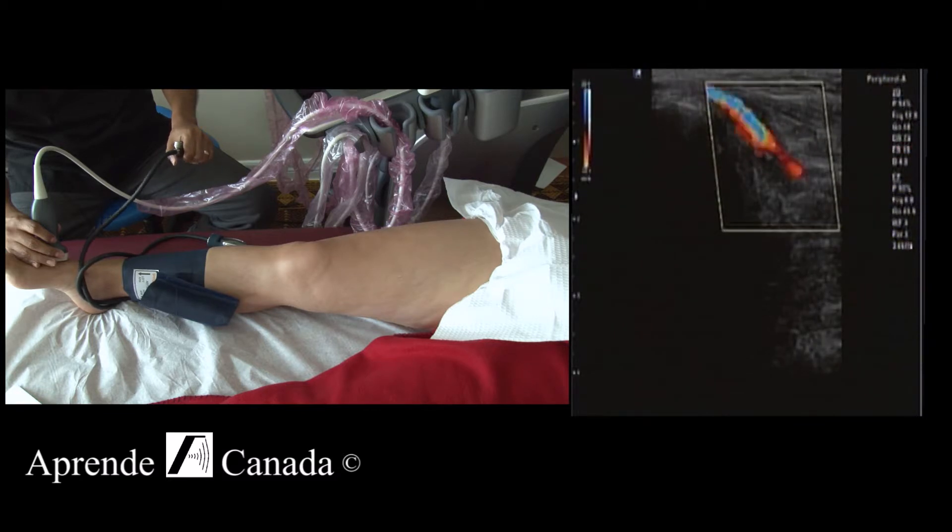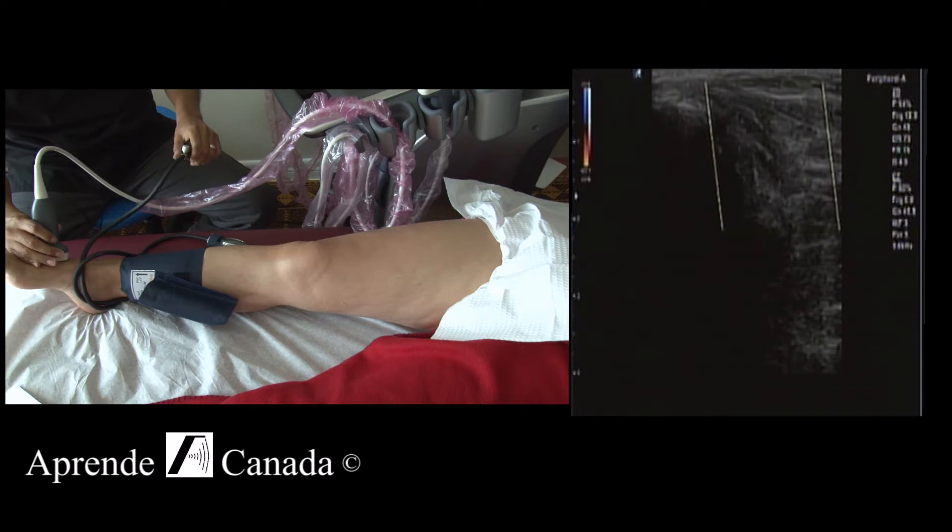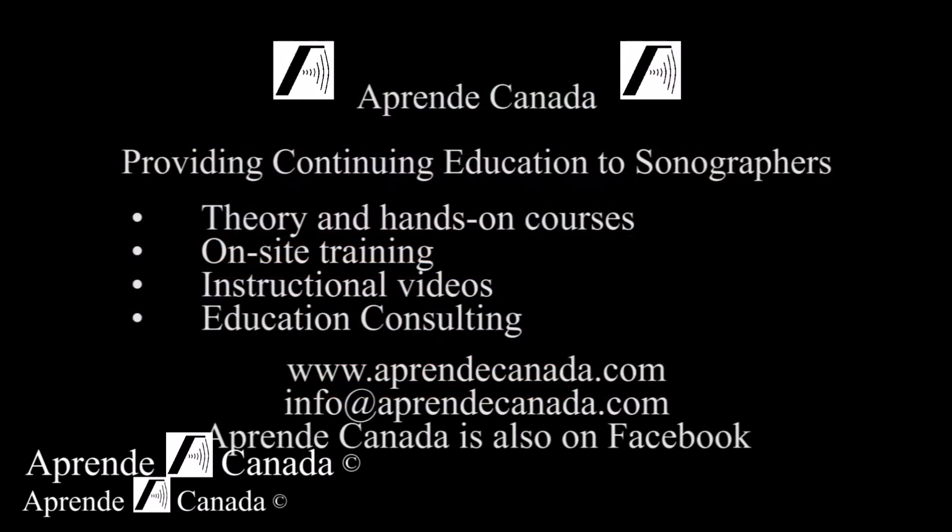We're pumping the air in. You can see how the flow starts to disappear now, right? We're pumping the air in — you can see that air in.